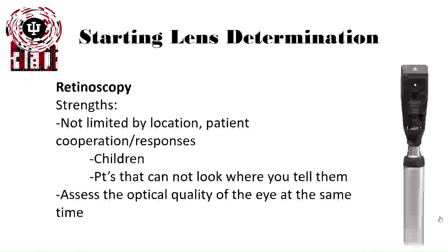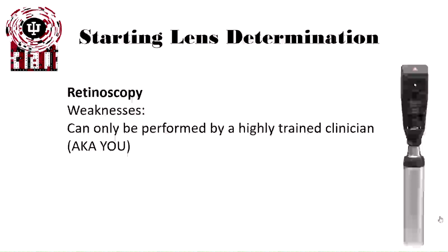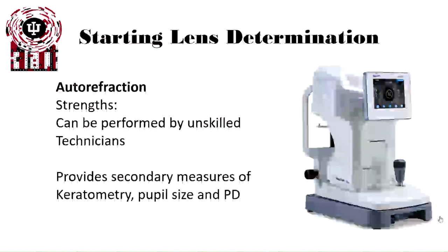Another side advantage of retinoscopy is that it assesses the optical quality of the eye at the same time. Some of the weaknesses, though, of retinoscopy is it's a pretty complex procedure, and so it can't be performed by untrained people. It takes a highly trained clinician, which is what you're going to become over the next few months as far as retinoscopy goes.